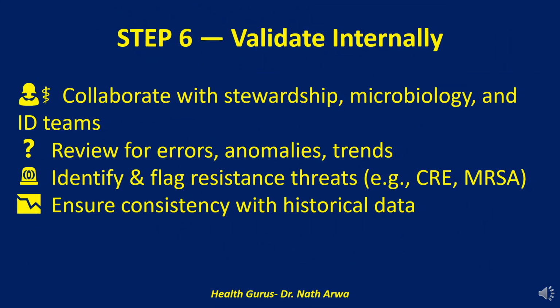Your antibiogram looks polished, color-coded, and ready to go. But wait, don't publish it just yet. There's one last, mission-critical step before you hit send: internal validation. This isn't a solo job. Pull in your antimicrobial stewardship team, your clinical microbiologists, and your infectious disease clinicians. Why? Because each brings a unique lens to the data. This step isn't just a review, it's a clinical gut check.